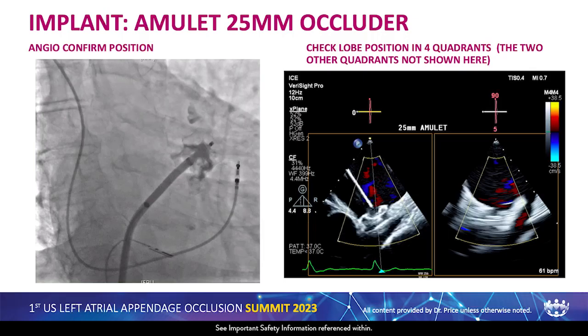So I take my picture here. It didn't play, but you can see, okay, this is what it looks like by angiography. Now, this is the 3D ICE. I only showed one image. We only saved one image.